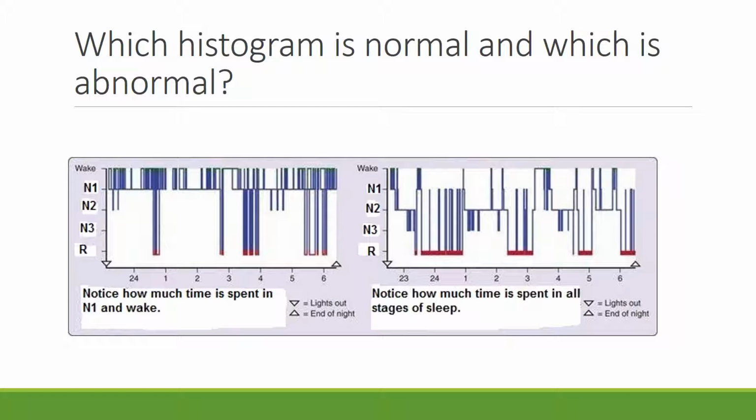So that's just an example of how you can take a look at a person's sleep architecture and gather a lot of information very quickly from it and kind of make an assessment through that. Let's go on to our next slide.